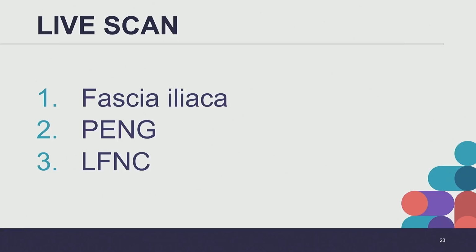Are you able to show the femoral nerve or femoral artery and vein somewhere up on the screen better? Yeah, so just keep that in mind. When you have your femoral vessels over here, there we go, the femoral nerve lies somewhere up here. So the point of using saline when I first hydrodissect down is that if you're hydrodissecting with local anesthetic, too much of that in the iliopsoas muscle can extravasate to the femoral nerve itself and cause quad weakness.